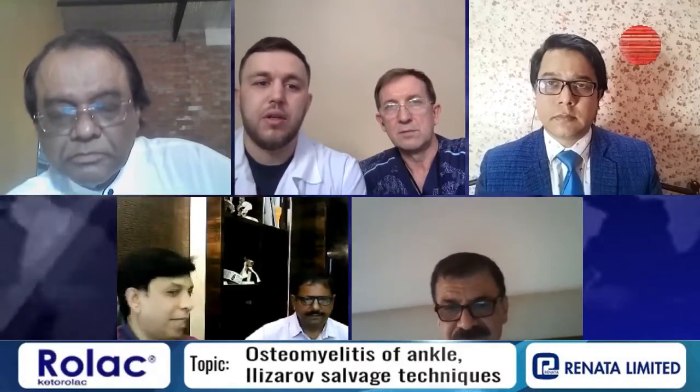So if we're talking about the technique of bilocal osteosynthesis, when we have a bone defect after debridement in the ankle joint location, and of course for healing that bone defect, when we do osteotomy in the proximal side of the tibia, the patient should be given 1 millimeter per day for healing that defect, and the patient should be given that distraction until that defect is healed.